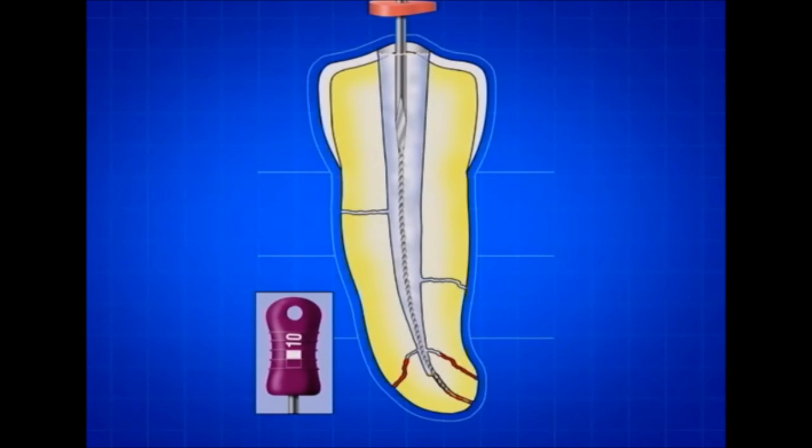Once the tip of the pre-curved file is apical to the ledge, it is moved in and out of the canal utilizing very short push-pull movements, with emphasis on staying apical to the defect. When the file slides easily, it is turned clockwise upon withdrawal, because this motion will tend to straighten the apical 1/3 of a stainless steel file and allow it to rasp, reduce, smooth, or potentially eliminate the ledge, which is typically on the outer wall of the canal curvature.